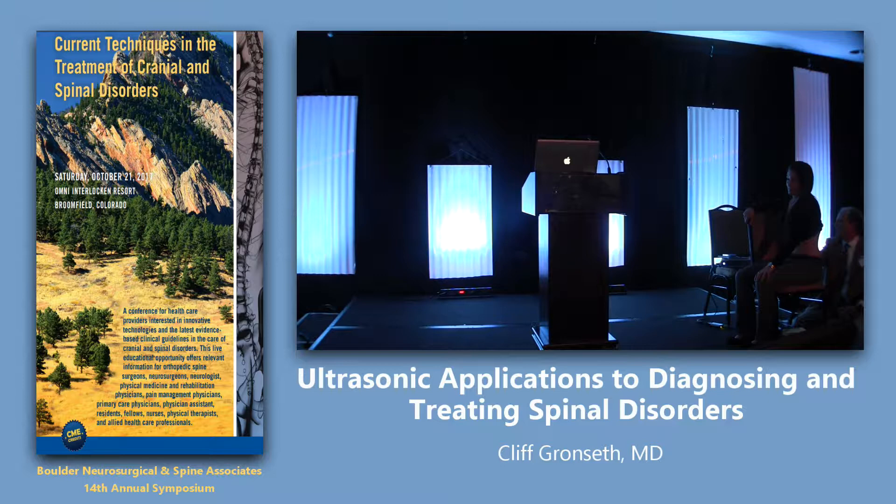Another use for ultrasound — and another source of potential back pain — is the kidney. That's a kidney in short axis view. If you want to look at it in long axis view, just turn the probe. And right next to the kidney sits the liver. This is the liver, there's the kidney. In the ER world, they look for blood right at this junction between the liver and the kidney — called Morrison's pouch.